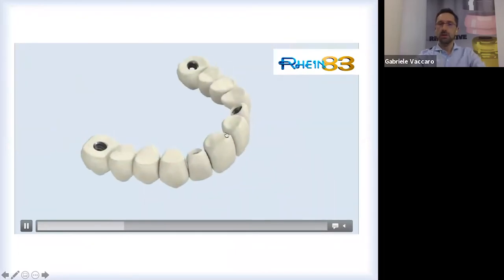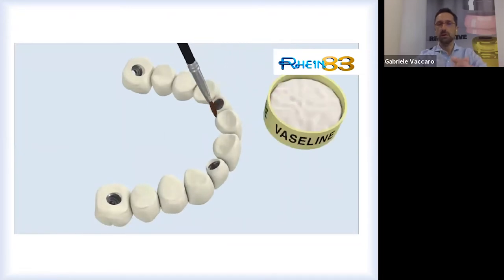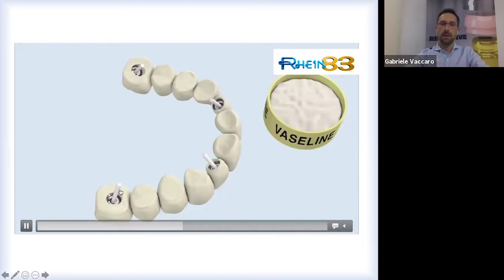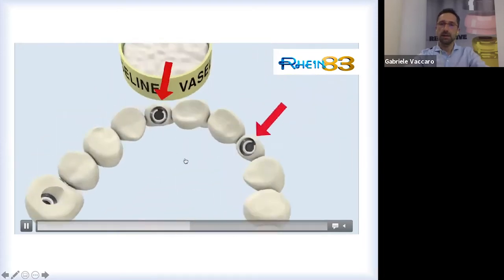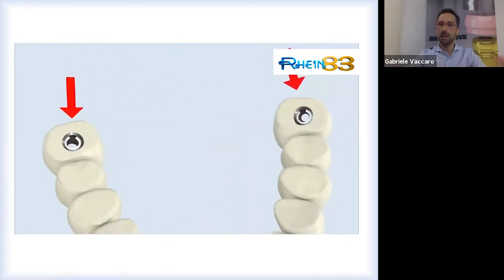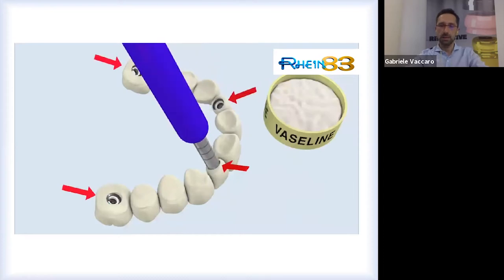So after you put some lubrication, of course, and after you put your Seeger ring inside the housing, then everything is locked by the path of insertion. You remove the handle from the Seeger, and then the framework is ready to be clipped on the implant platform, over the implant platform. You check that the clip is right with the special tool.